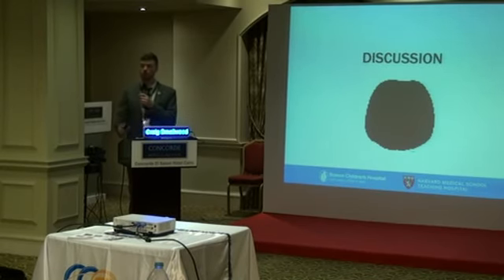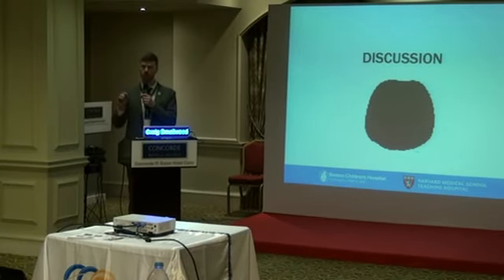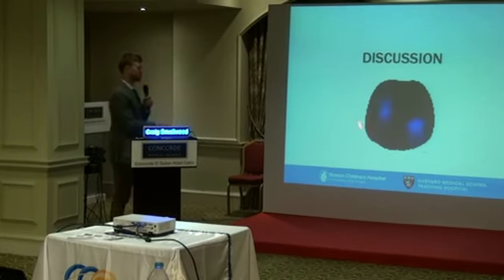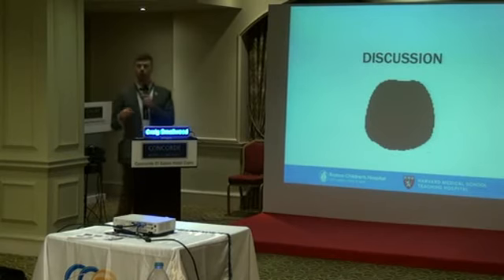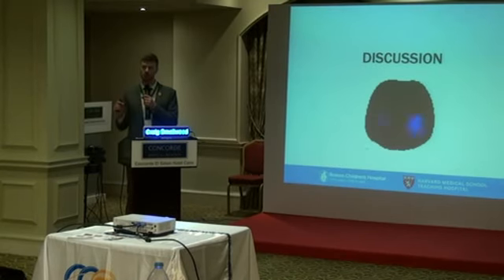Yes. Yeah, so on the Draeger device, and I think on many devices, you can save an image from a previous time, and what you can do is compare that image to your current one. And so you can look not exactly at an image like this, which is like a dynamic inflation. You can look at one that's even a little bit more fine grain and shows you differences whereby there are increases or decreases in impedance. I think that's perhaps what you're asking for.